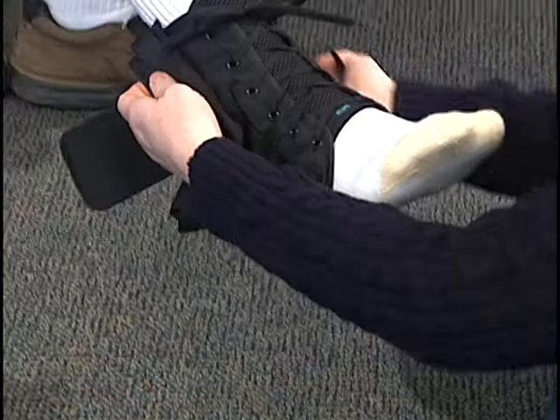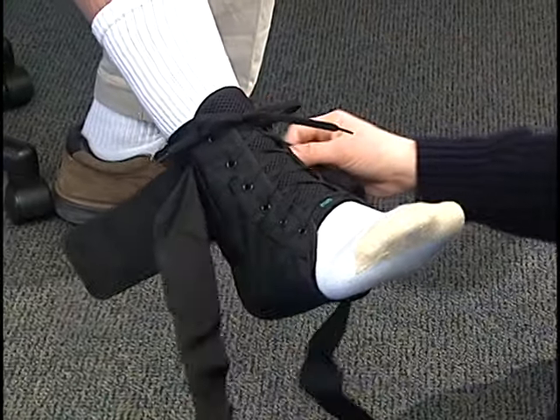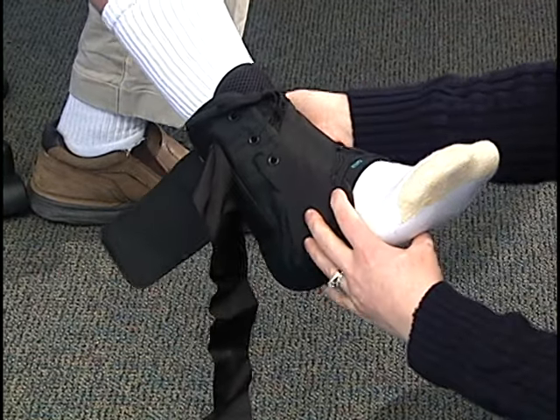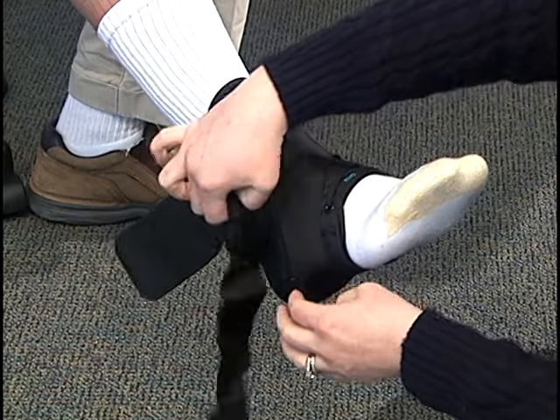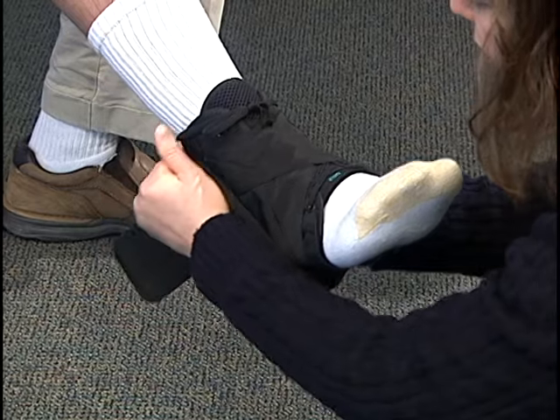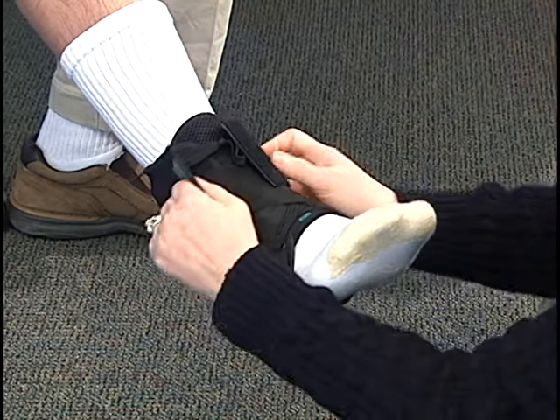We'll begin with your inside strap coming across the top, under the bottom, and snug it up on the inside. And finish it up with your back strap. Then take your outside strap from across the top, under the bottom, and up on the side. And finish it up with your back strap.